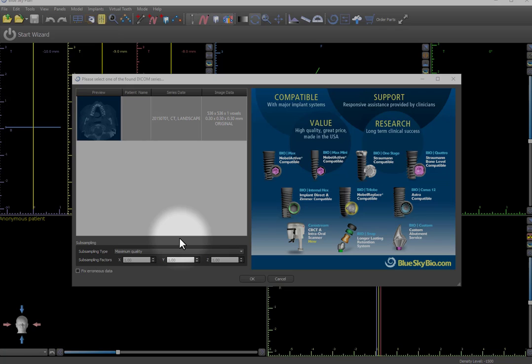There are several ways of improving the image quality in Blue Sky Plan. One important way is to start with larger 2D images, which can be accomplished by cropping the DICOM images to just include the field of interest.